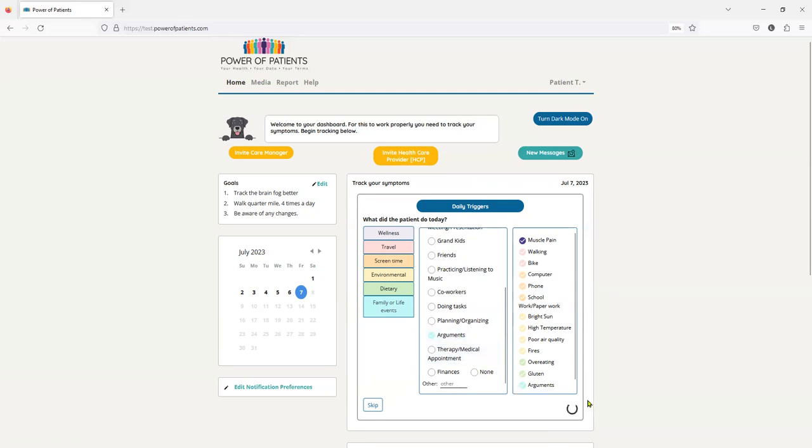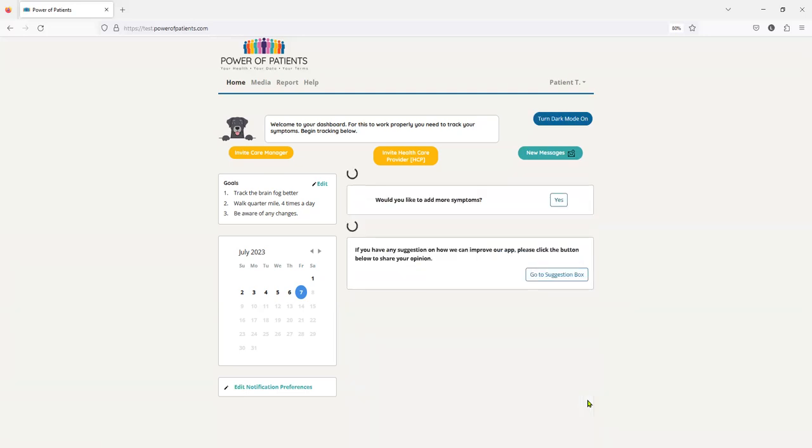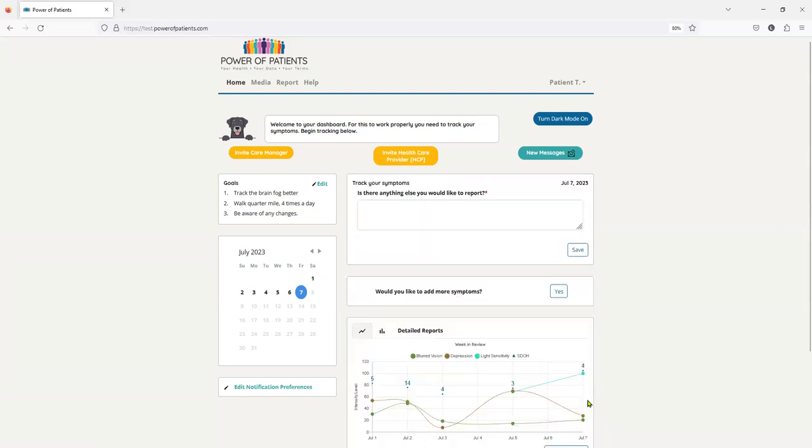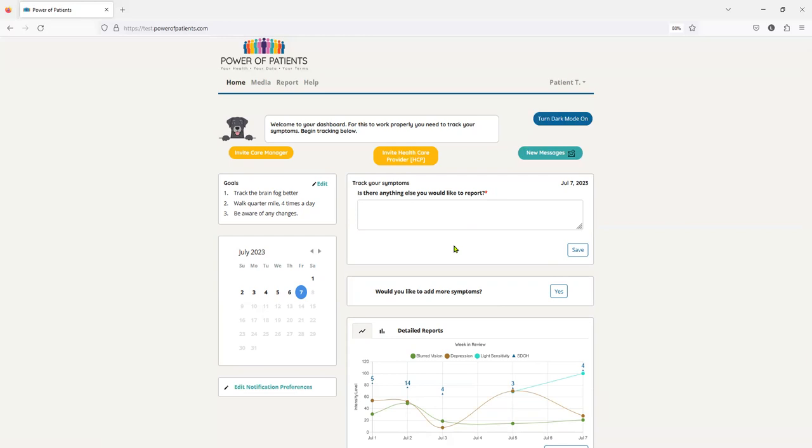So that is how fast a patient can actually track on a daily event. And if you notice, we allow them to journal throughout the day. So if something happens, if they track first thing in the morning and then everything falls apart, they can come back into Sally and they do, and they just track and tell us what actually happened.